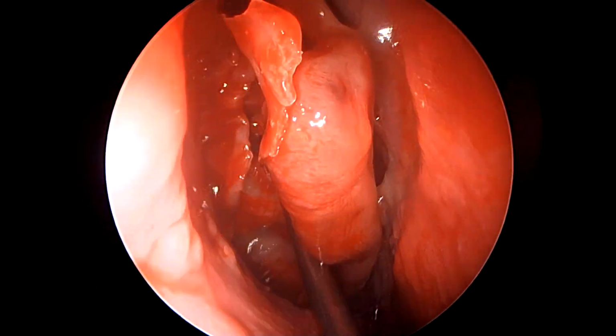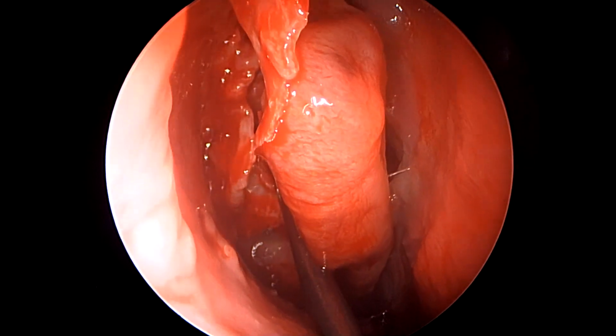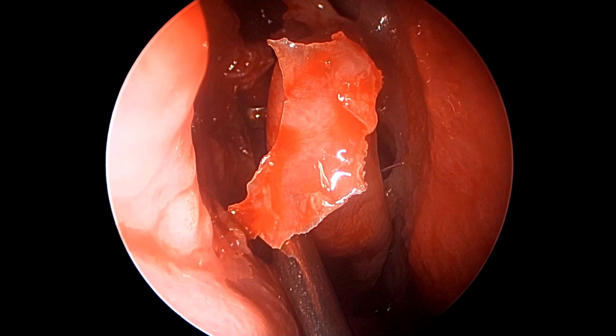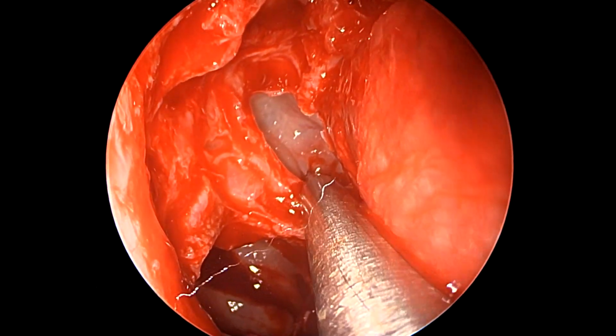Sometimes it may so happen that even if the posterior ethmoid or sphenoid are not involved, they could simply be opened to locate the skull-base trajectory, and sometimes that would also be a reasonable way to follow your way high up into the frontal skull base from posterior to anterior.